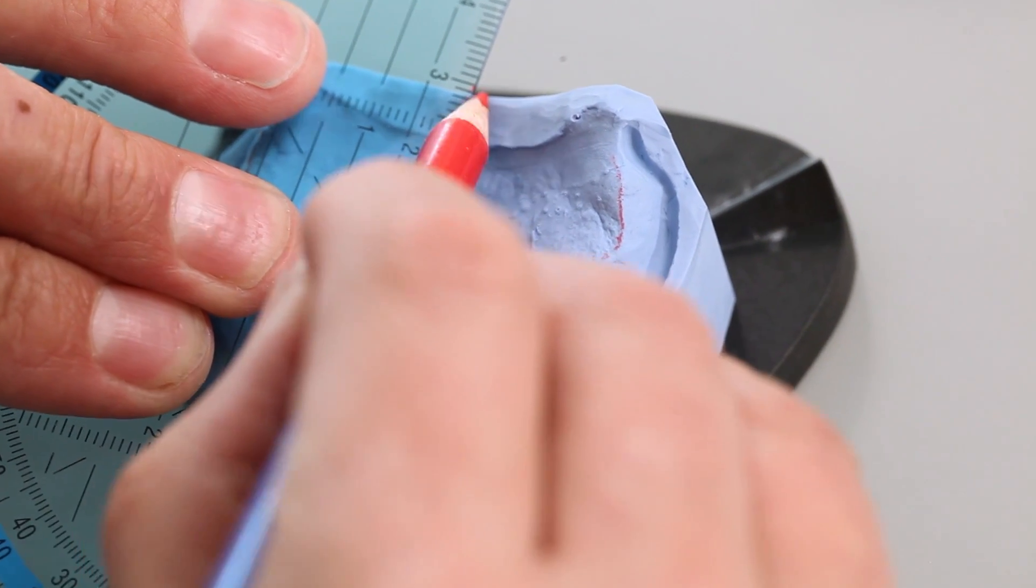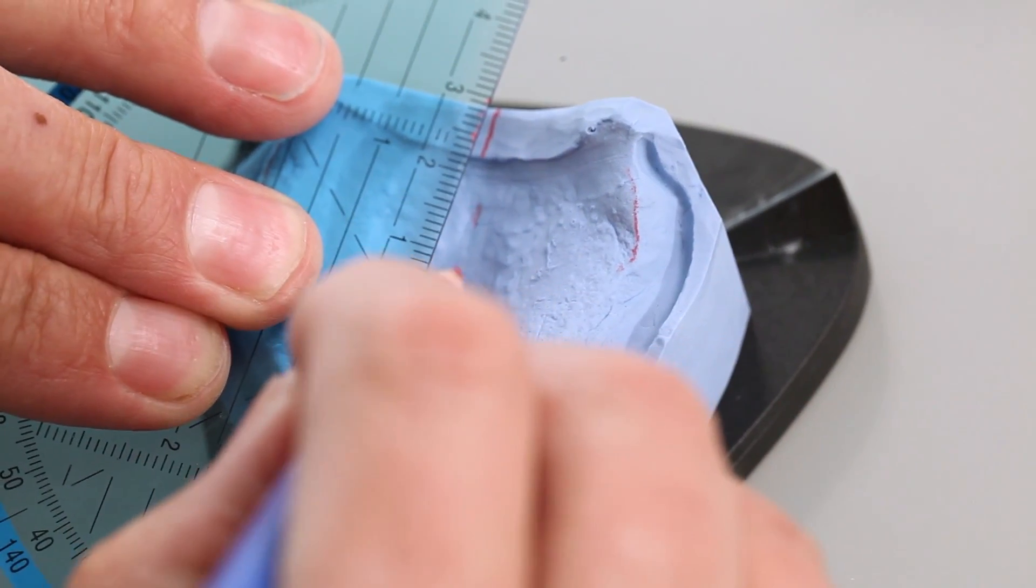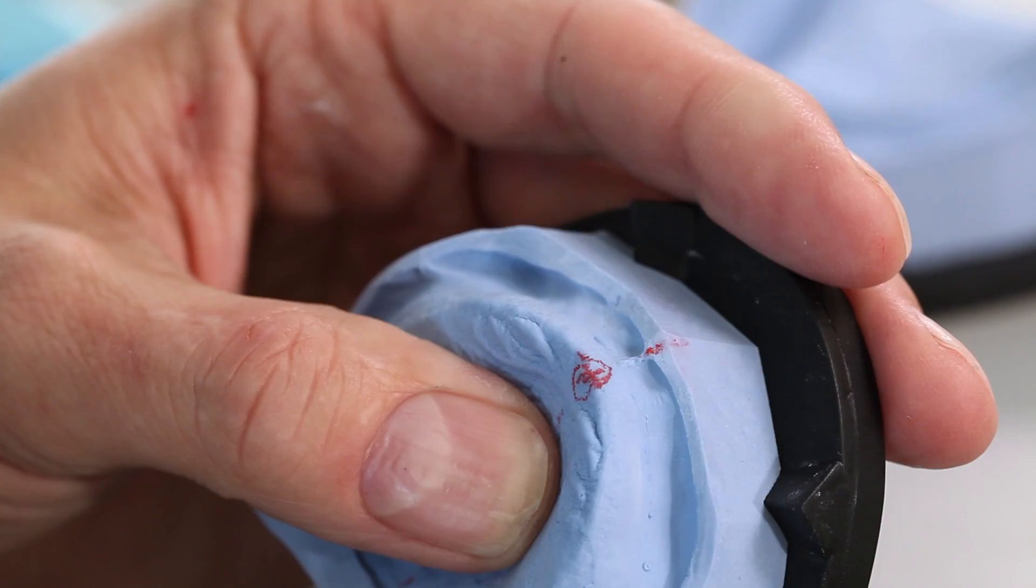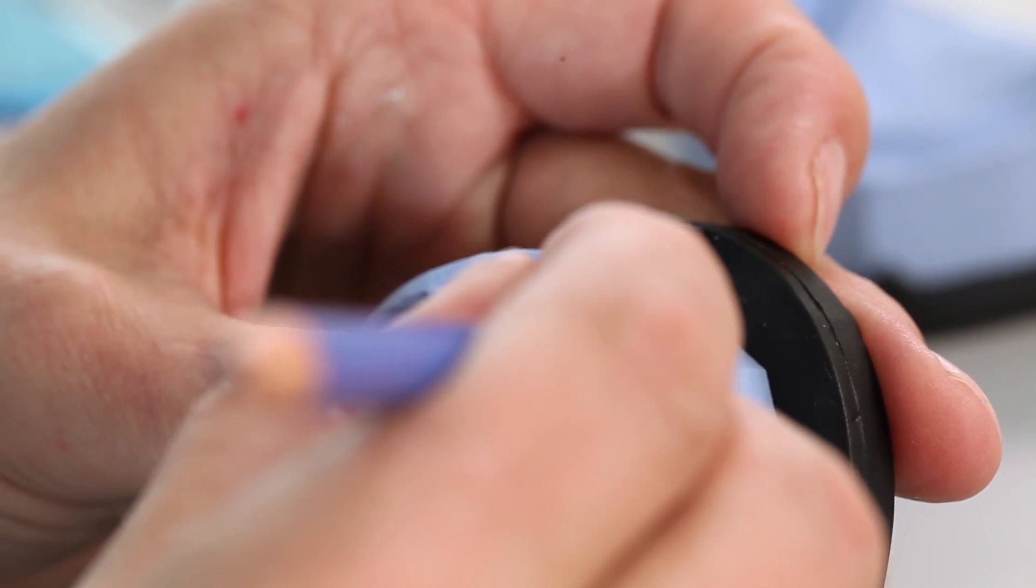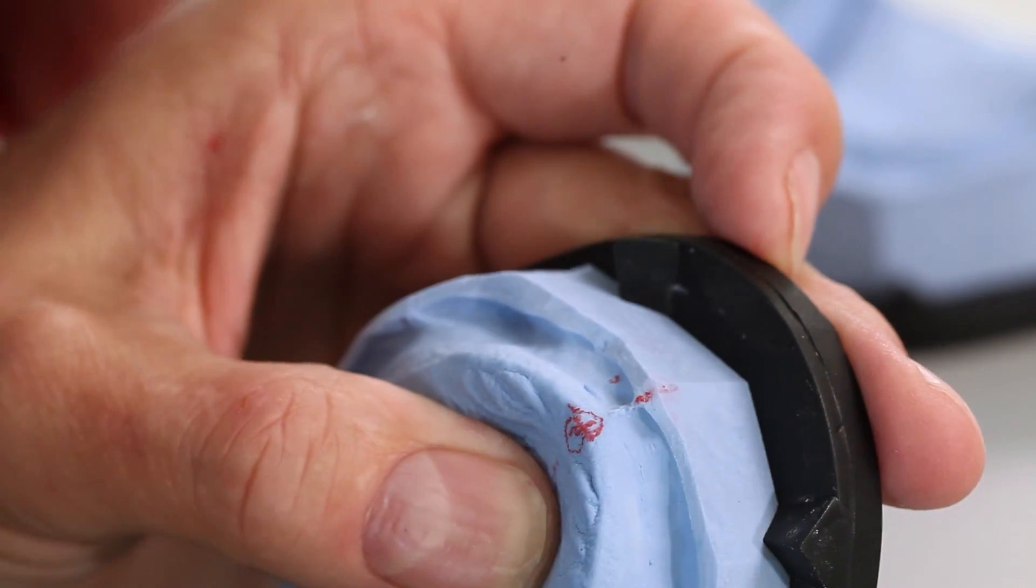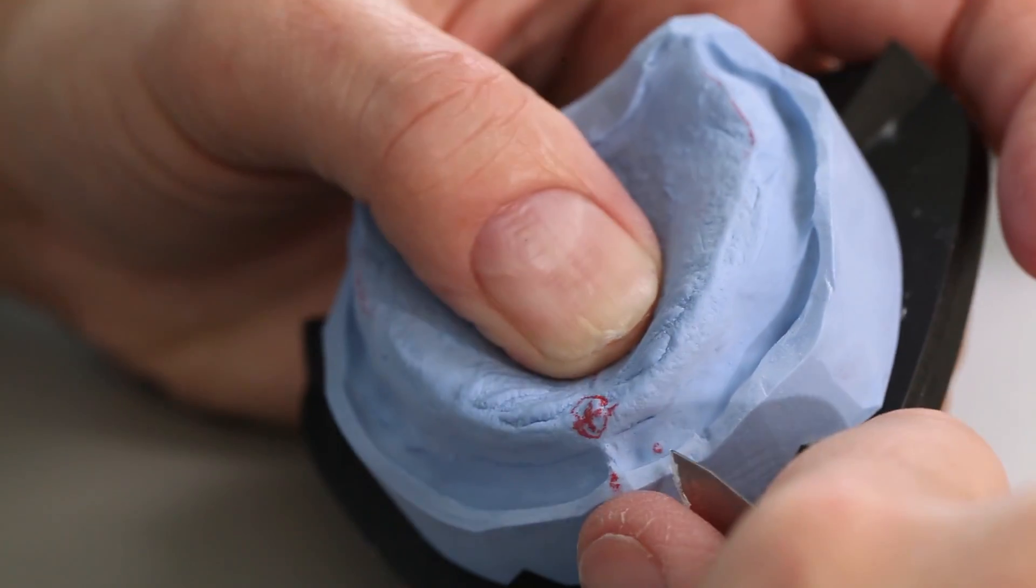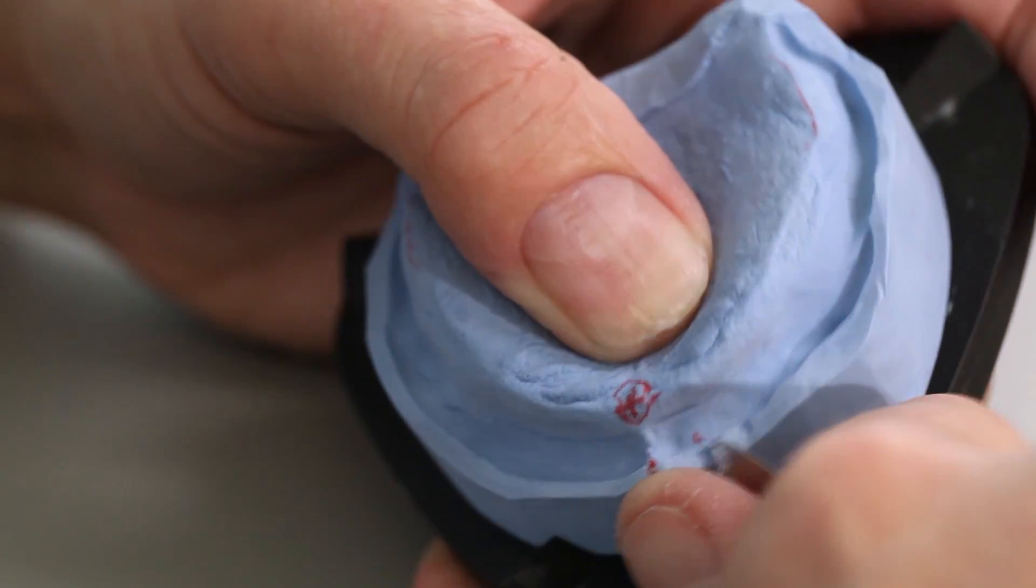Extend the midline to the edge of the model. Mark the lowest point of the vestibulum. It is situated approximately 5mm away from the labial frenum. Expose the vestibulum.